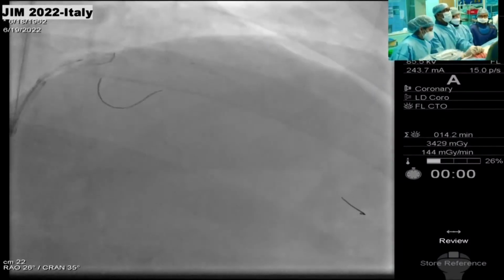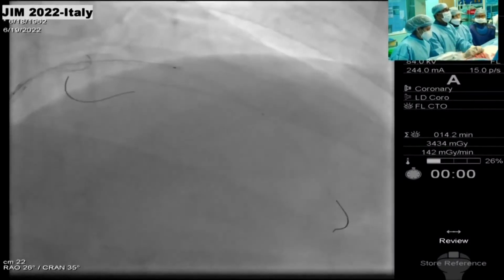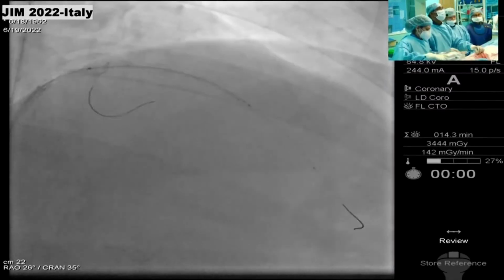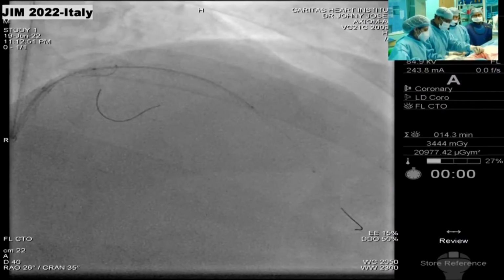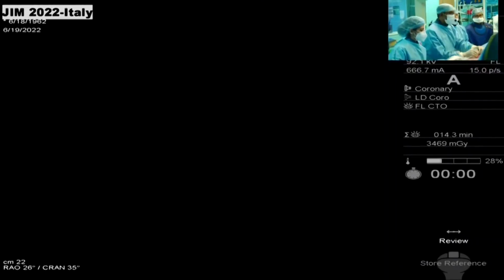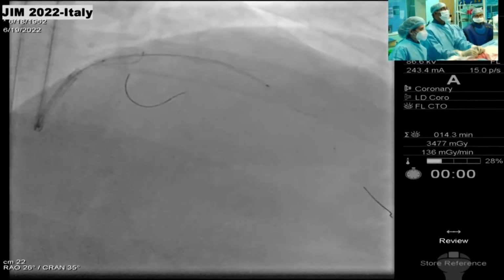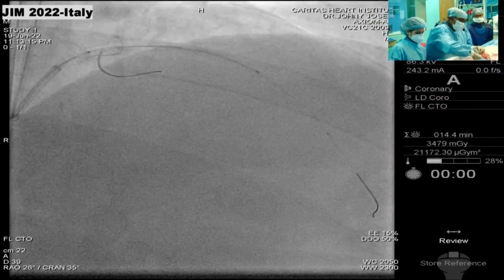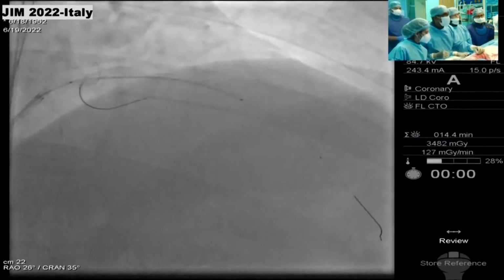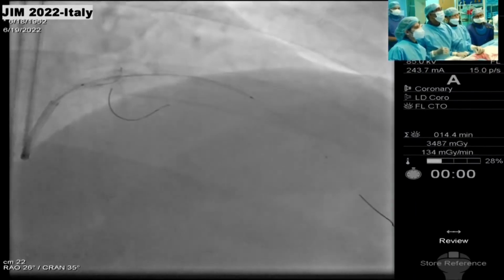You know why they do that, George? Left main in the US almost automatically means Impella. Here there is a normal left ventricular function, so you won't consider that. No, hemodynamics remain extremely stable. I will not, but I definitely back out the guide before the OCT. Let's see how it works.